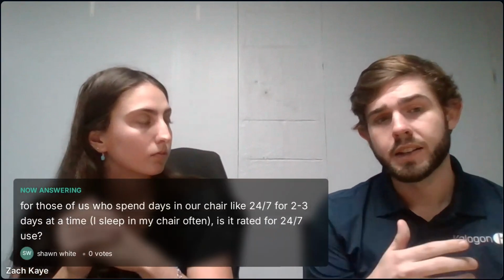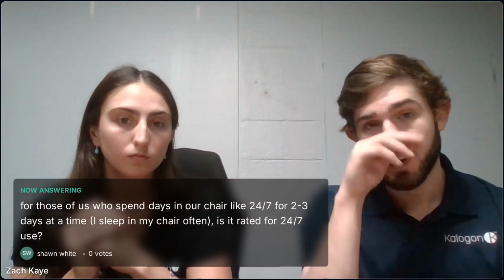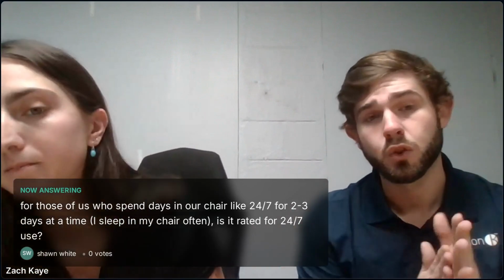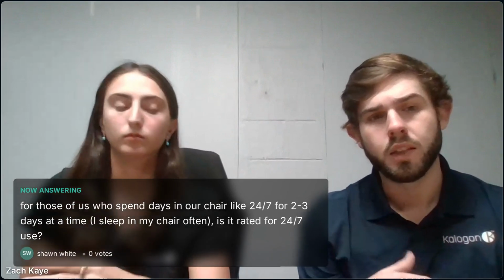And then Sean, as you asked, for those of us who spend days in our chair, 24/7. I have many users that use the cushion continuously throughout the day. They just keep it plugged in if they're near an outlet to keep it charged. Or if you have a power chair that has the XLR port on it, you can actually charge the control unit from the XLR port. That way the cushion just stays continuously charged. You get about an 18 to 22-hour battery life, depending on the redistribution mode and how frequently it's having to adjust.